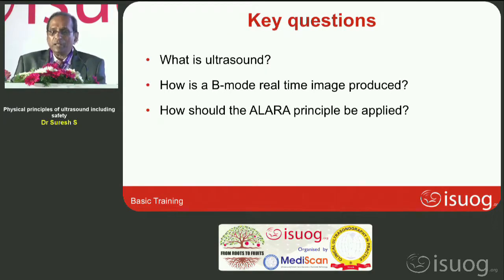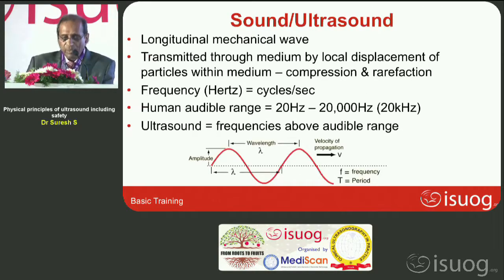The key questions are: what is ultrasound? How is a B-mode ultrasound real-time image produced? And how should the ALARA principle be applied? So let's start beginning with the sound.